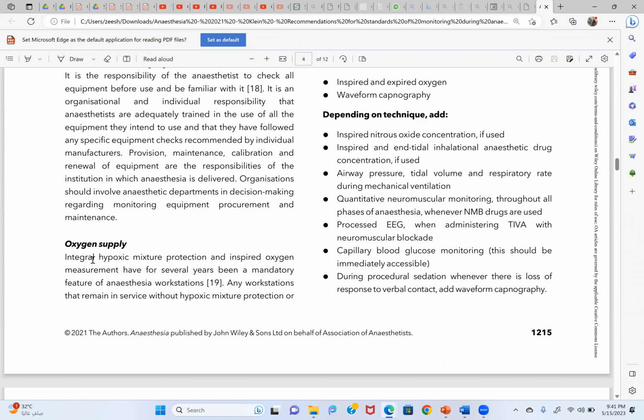Usually people, even anesthesia technicians, never check, so you should check yourself. The anesthesia emergency cylinder should be there. Similarly, with the central supply, of course, there is a mechanism to check the central supply pressure, the tug test.